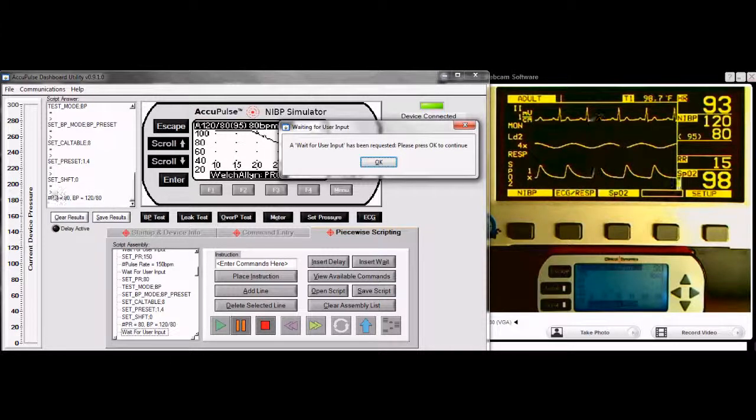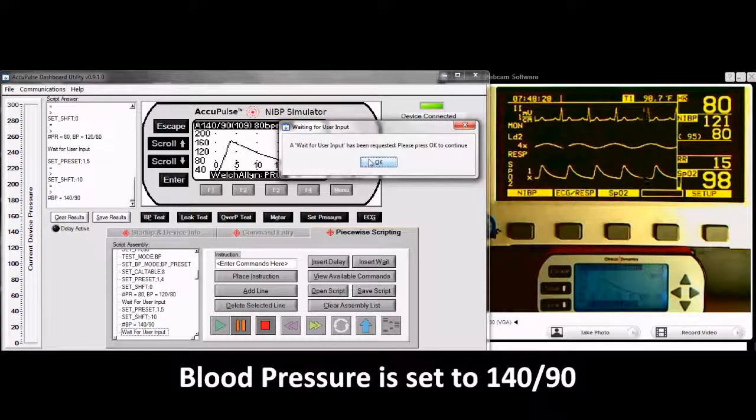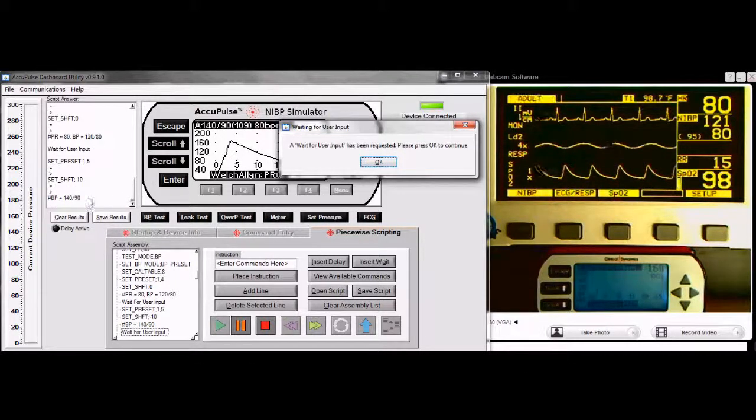The second category of script files relates to the system's ability to play out customized sets of physiologically correct vital signs and trends over time. Clinically relevant scenarios of stable and unstable vital signs may be generated. Response to identification and treatment of clinically significant medical conditions may be simulated, allowing for teaching, training, and evaluation of competency.